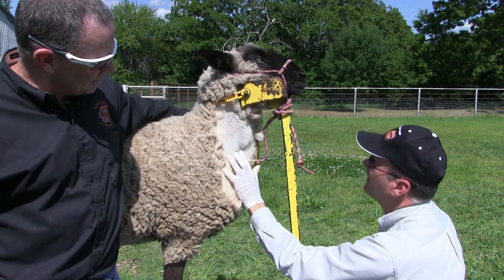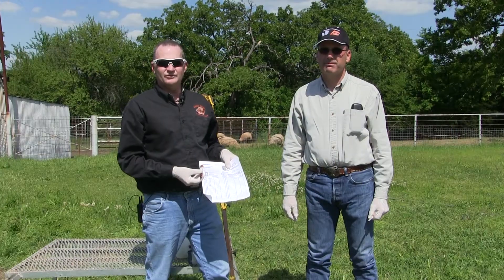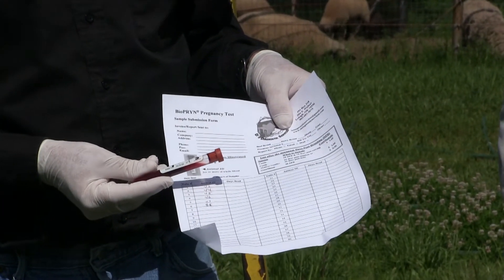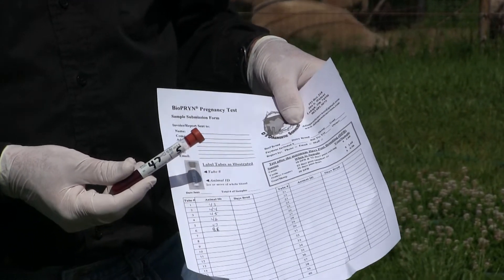He's making sure to apply a little pressure so the bleeding stops. In most cases with wool sheep it's going to stop pretty quickly. Once we've collected the sample, we label the tube with the animal's identification number — in this case tube number five with ear tag 47.